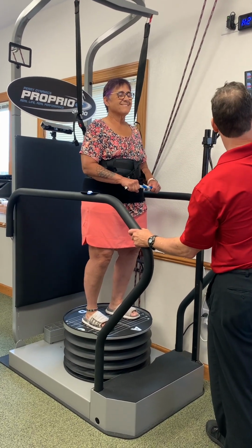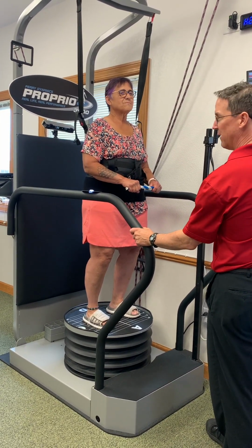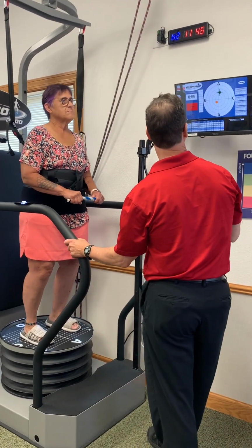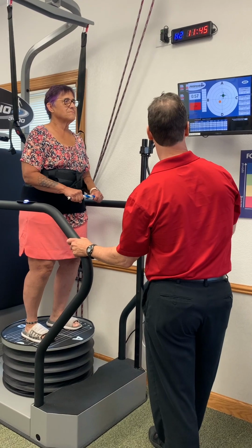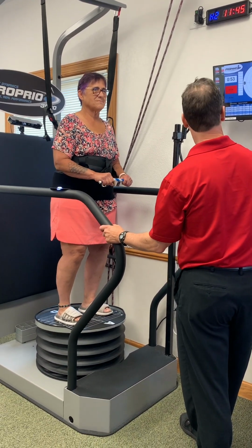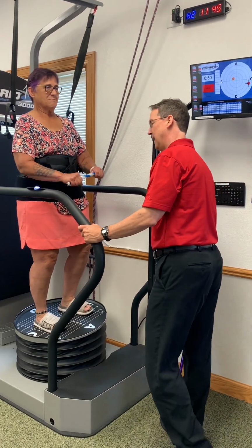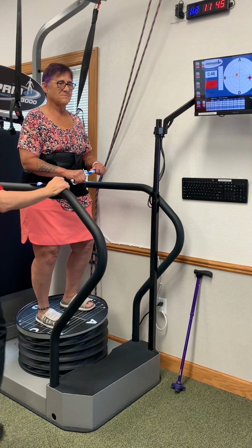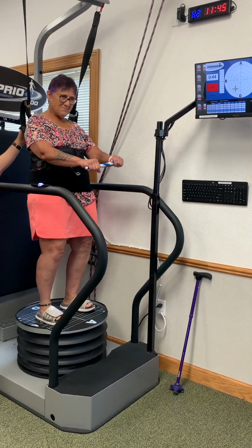Just going to pause for a little bit, counting down. You can play little games, have them see where they bring that dot back to the center. We don't need to get into all that. So now it's a little bit random. It's moderate speed, moderate distance. I'm going to go to her side. I think towards the last 15 seconds of this, it feels like she's probably on a boat.